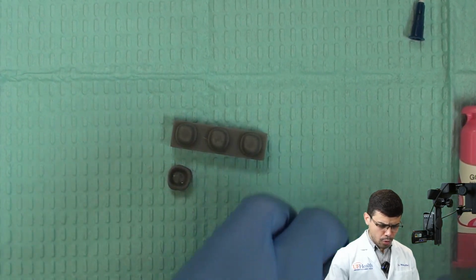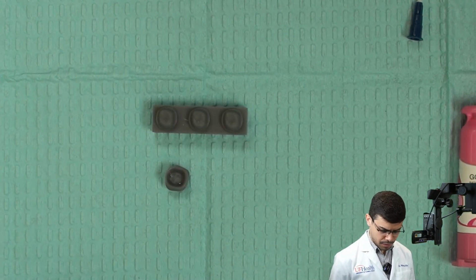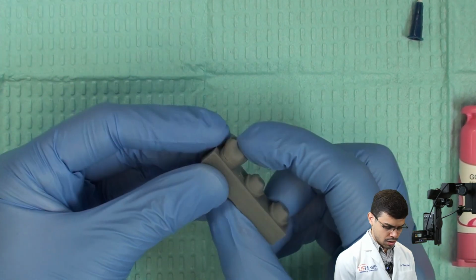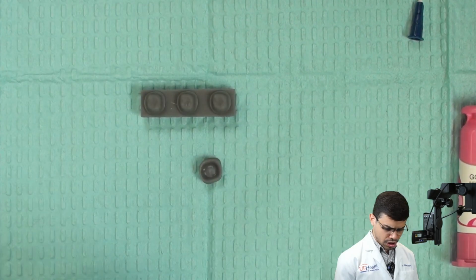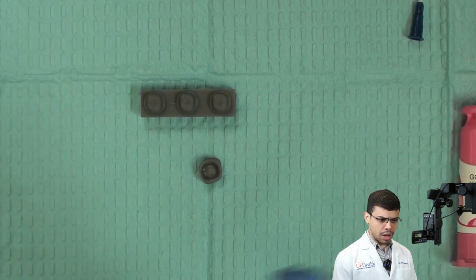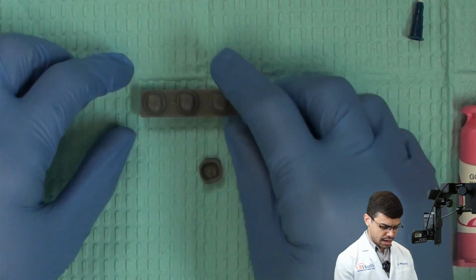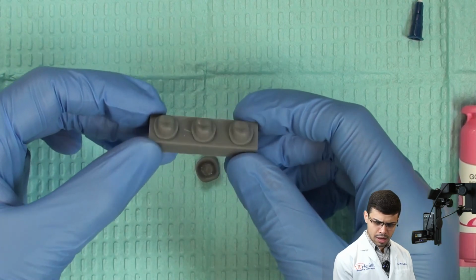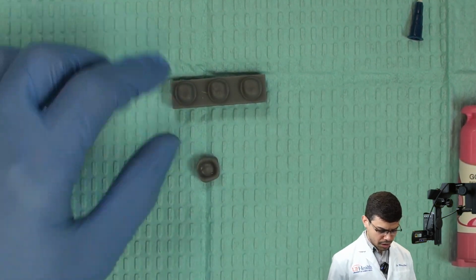All right, so for the full metal crown, and full metal crown also represents what would happen with the PFM, the first thing that you need to do is try in the restoration to make sure that it's going to fit. So here it's fitting pretty good. And then you're going to have to select which clinical procedure you're going to use. If you're going to do a luting or bonding, and if you're doing luting or bonding, which cements you have available for you. So in this case, I will select luting because I have a good preparation here that has all the retention and resistance forms that I require for this prep. So in this case, I'm going to use this one.